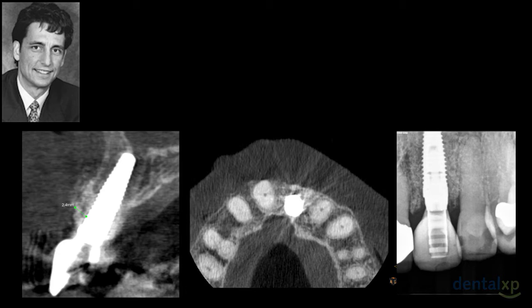If you do this procedure on a regular basis, we do almost every case of ours as an immediate, at least in the anterior maxilla, and as often as we can in other areas. We've just found it so demanding that the patients are asking for this. If I could do it as a staged approach, I think that obviously that would be the best, and we review that with the patients. Ironically, even when faced with risk, the patients usually make that decision.